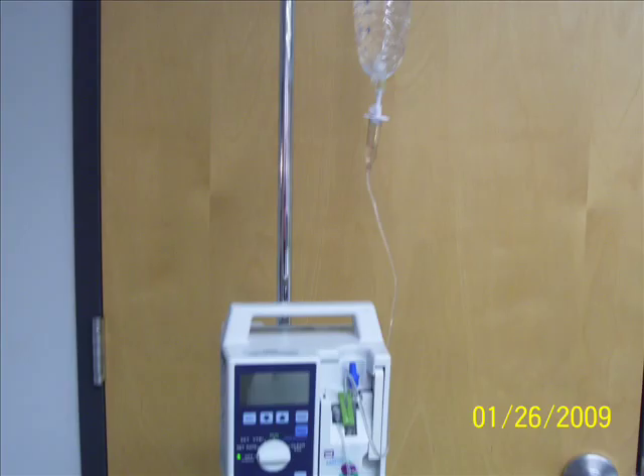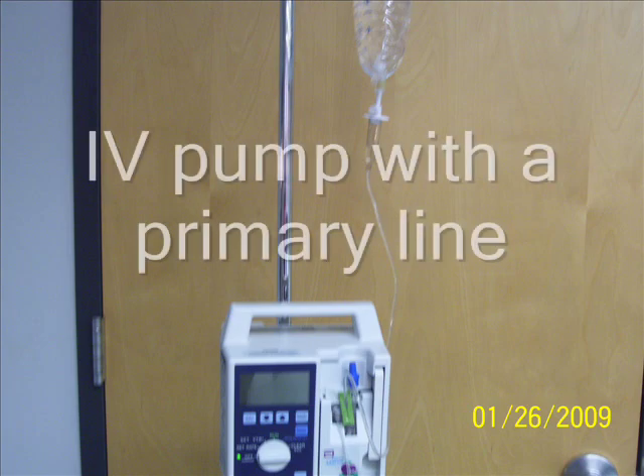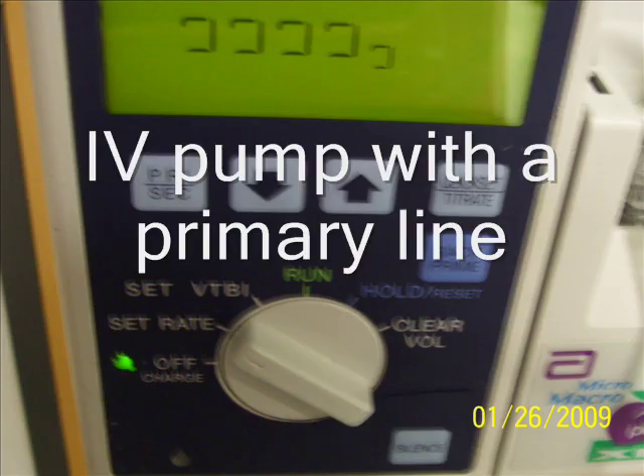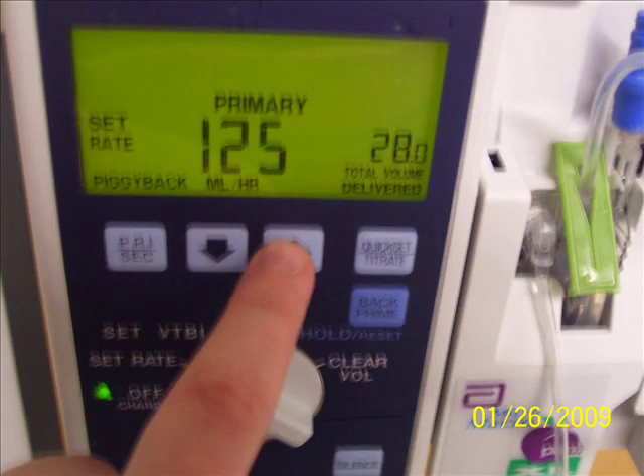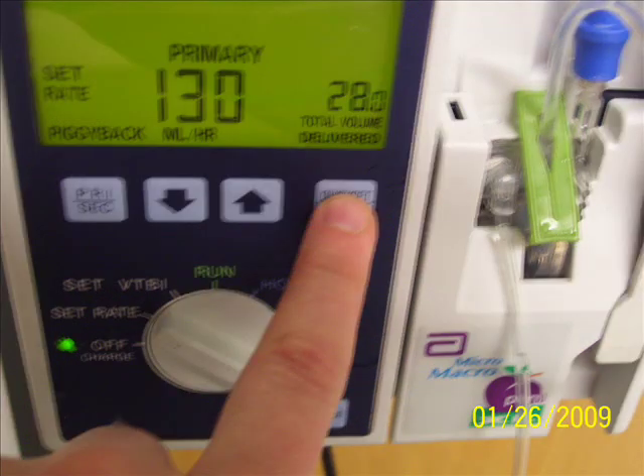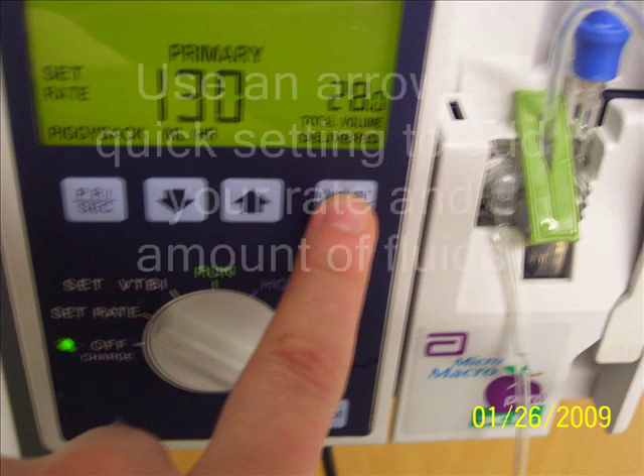It's a really smooth process. There is no need for pushing or doing anything inappropriate. Now we are closing the latch, and pretty much the cassette is in and we can continue with our setting. This is the primary IV pump with the primary line, and that blue top that you see is a top to attach the secondary line. Now we are setting up our pump.